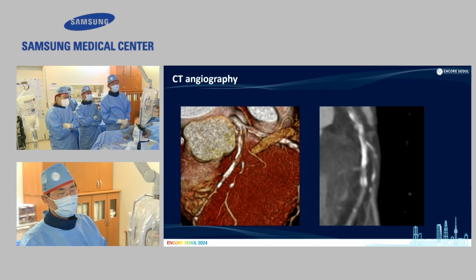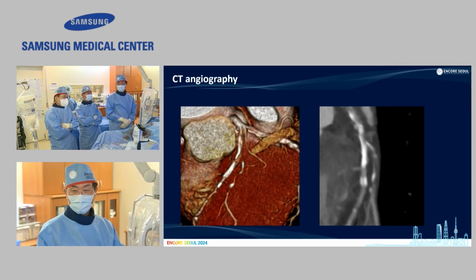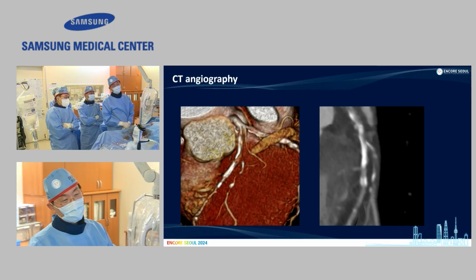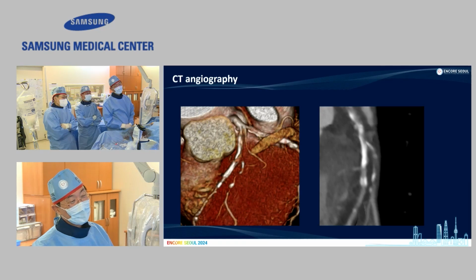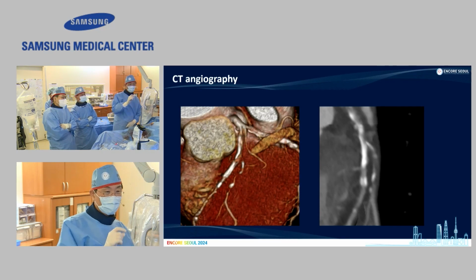I tried to find a hint of where the diagonal ostium begins. I'm not sure. I think I need to target the small calcium in the diagonal artery, maybe very near to the ostium.